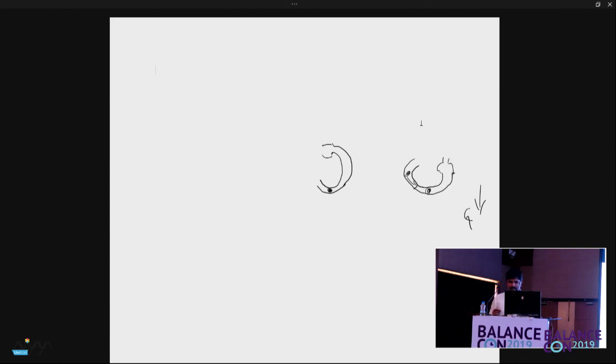Now, next thing is this. From this position, the person comes back to supine. Okay? So from here, he was in the right lateral position. From the right lateral, he goes back to the supine position. Now what will happen? This had reached this place.